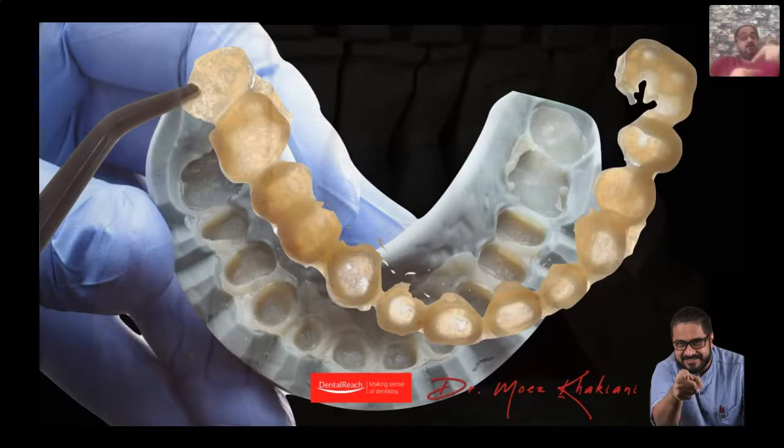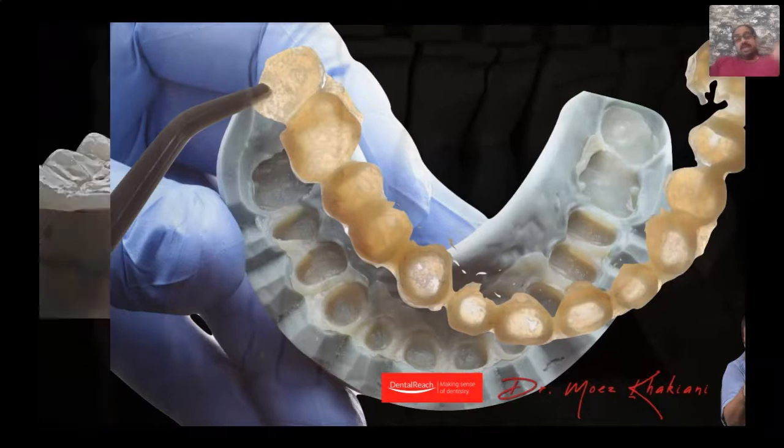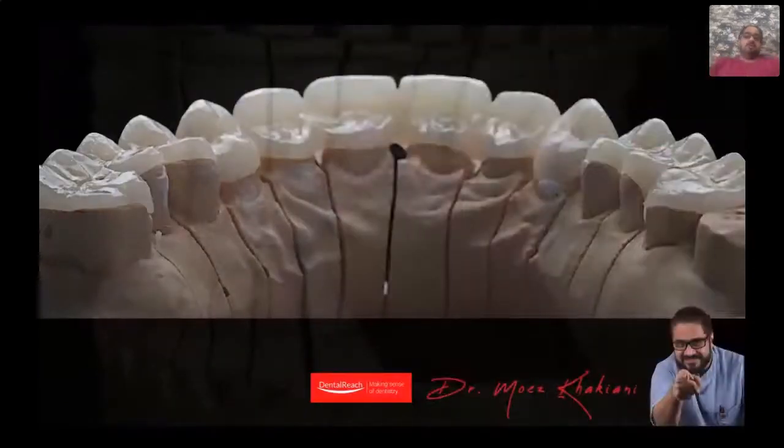Some peripheral reduction to get my anterior guidance correct. And this is how the laboratory sends the prosthesis back. Look at all those posterior palatal surfaces. These are classic tabletops where only the occlusal portion is covered. Look at how thin they are. On average, we say between 1 to 1.5 millimeters is more than enough.